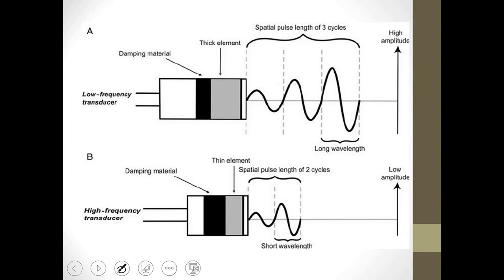Then subsequently, something known technically as ringing occurs, which resembles a tone. If one brings such an object close to their ear, you will hear sounds akin to bell-like tones, or specific rings. This ring lasts longer or ceases depending upon whether one holds on to the tuning fork. After striking the device and making your own sound, if you stopped its vibration, what then happens next? Will you still continue hearing residual sounds emanating from it, or will they cease entirely?